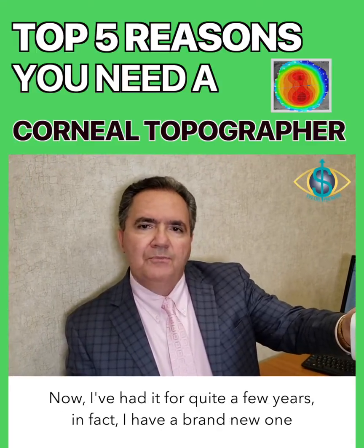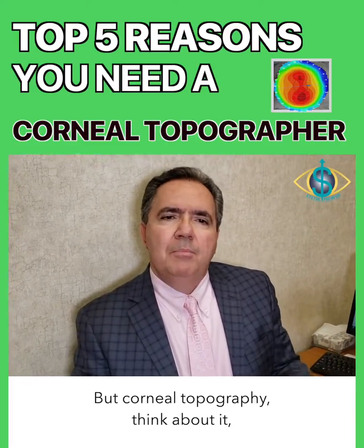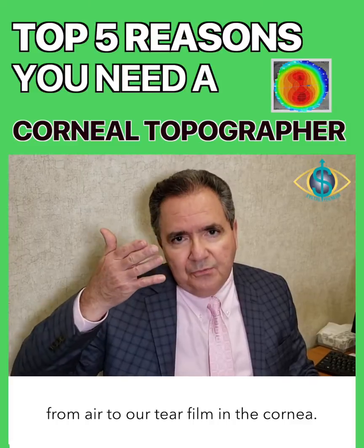Now, I've had it for quite a few years. In fact, I have a brand new one that I'm going to be installing, and next year they have an update even further than that. But corneal topography, think about it. Our main refractive surface is from the interface from air to our tear film in the cornea.